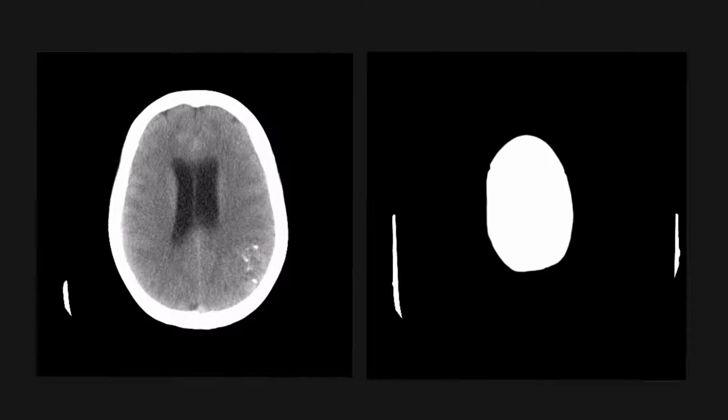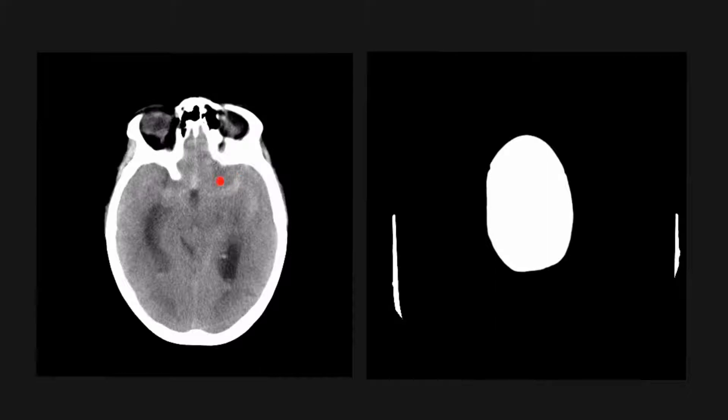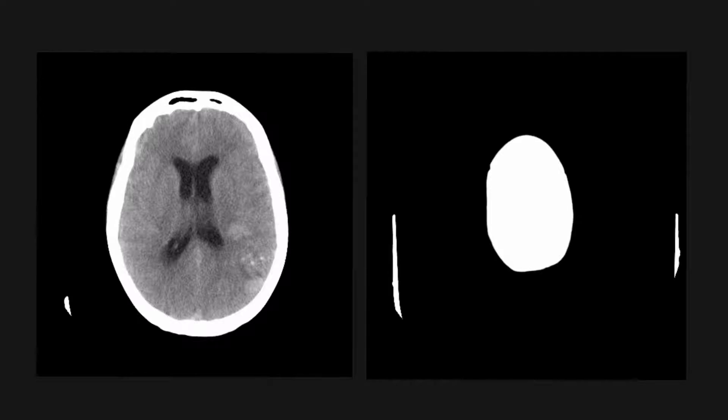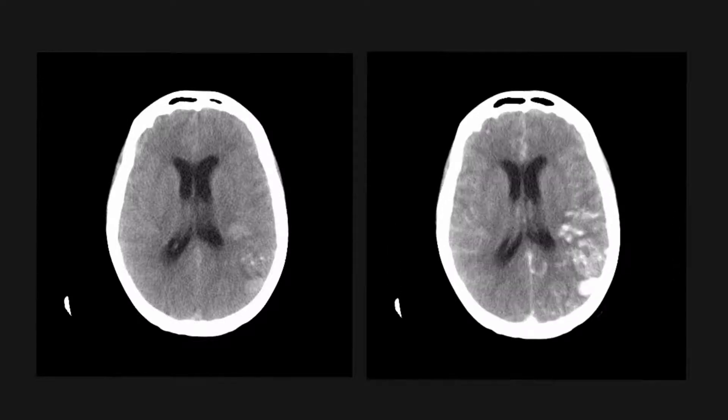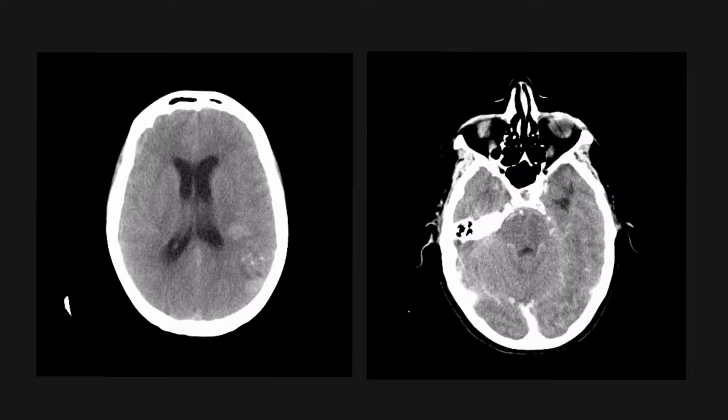Subarachnoid haemorrhages can also be due to AVMs as mentioned. In this case, we can see abnormal calcification in the left parieto-occipital lobe, in keeping with an AVM which has bled and caused an acute subarachnoid haemorrhage. This has led to sulcal effacement as well as hydrocephalus. This post-contrast scan confirms the AVM with acute subarachnoid haemorrhage.